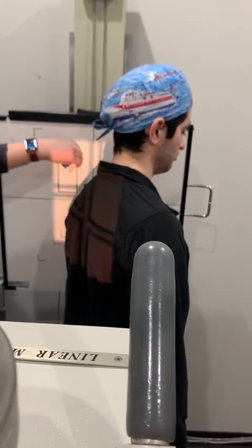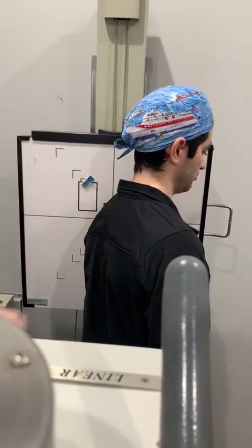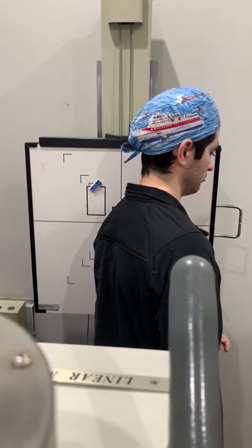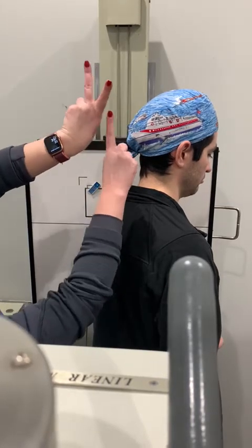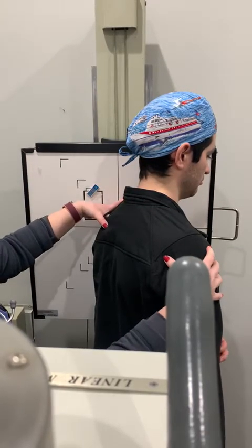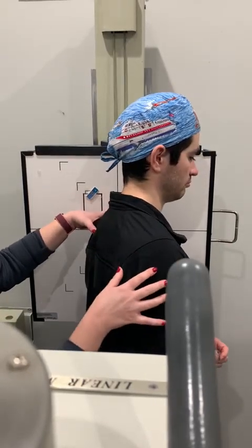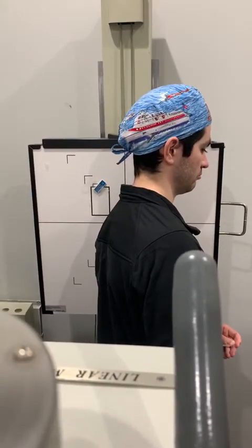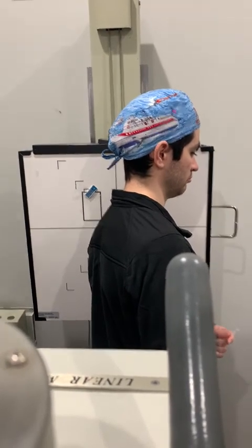Move the marker over and move the board up to match where your line was, then take the image. My suggestion is to not move the patient once you go take a look at the image. Tell the patient to stay exactly how they are so that if it doesn't look like a nice perfect Y, you can look at the picture and tell which way you need to rotate them — a little bit more forward or a little bit farther back. If you have any questions, give me a call and I'll assess the picture for you. That's the simplest way I can put it.